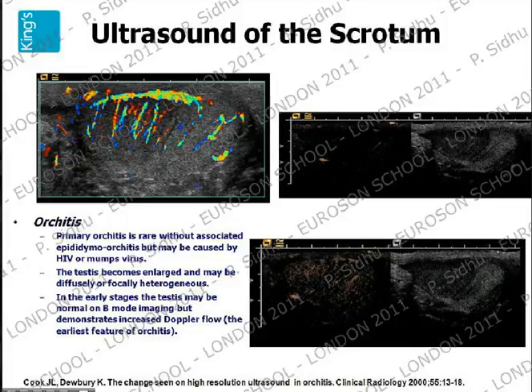Now, that focal mass in the top aspect of the testes is probably not a malignant tumor, because I did mention to you earlier on about the crisscross irregular vessels, and look how linear those vessels are. And this is confirmed on your ultrasound examination of being uniformly enhancing and linear as the rest of the testes. And this is a focal area of orchitis. You can sit and wait on that rather than taking the patient out.